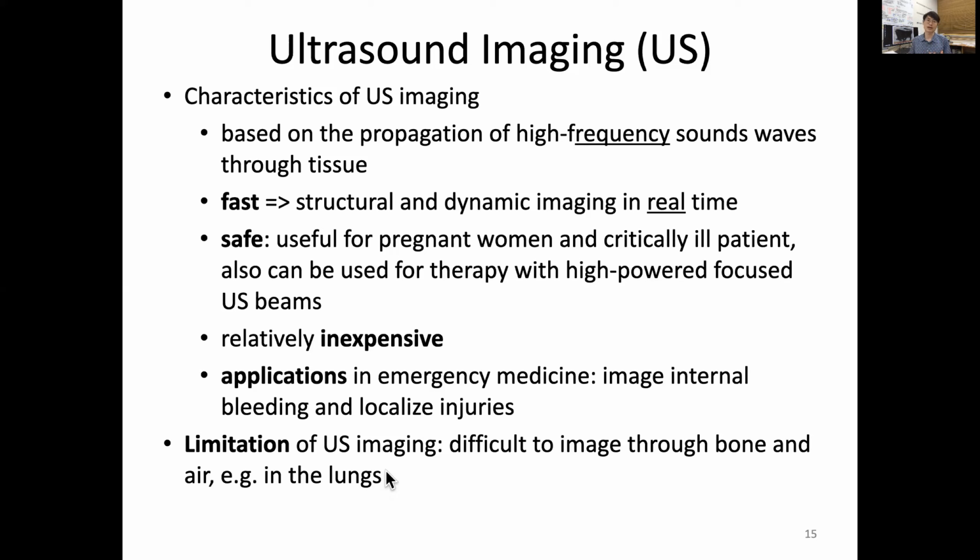So there are limitations. And another limitation I can think of is that we are using sound waves, and there could be noise involved. So the resolution usually cannot go below cellular resolution.